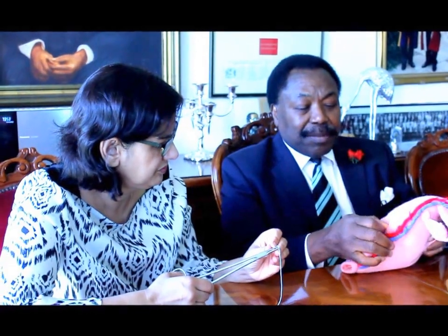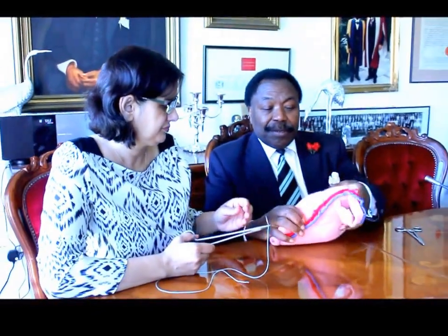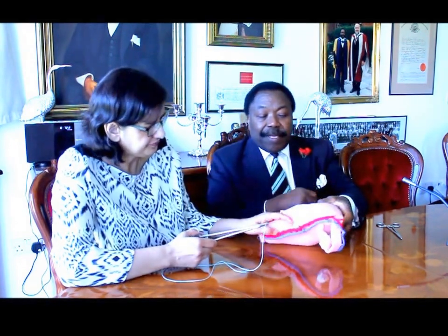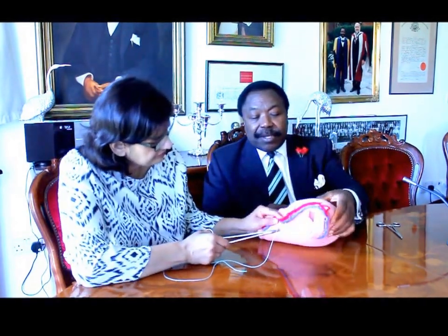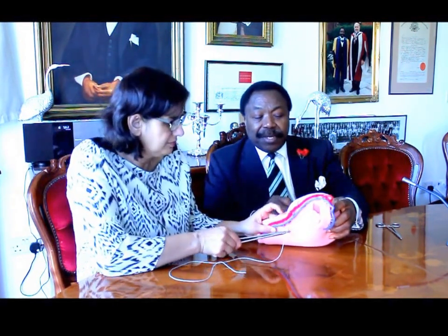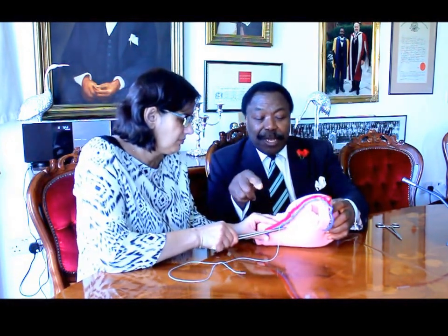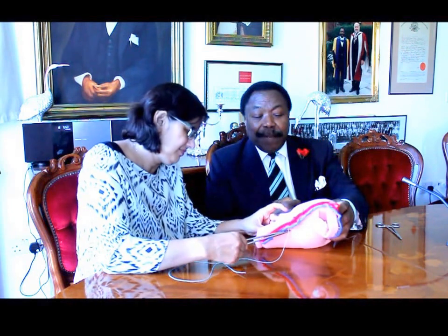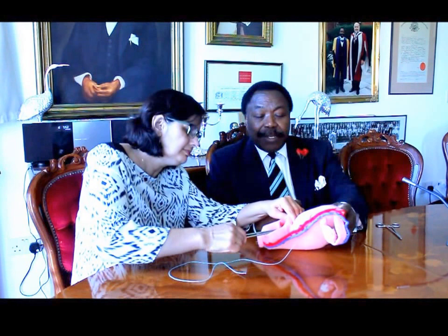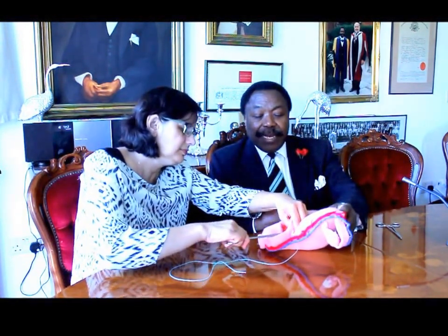I will pass this model to my assistant, Dr. Javid, who will perform the procedure. You will see the first thing she does is, 3 cm above the upper incision margin, posteriorly behind the vascular compartment or vascular bundle, the needle pierces the uterus and is retrieved in the cavity.